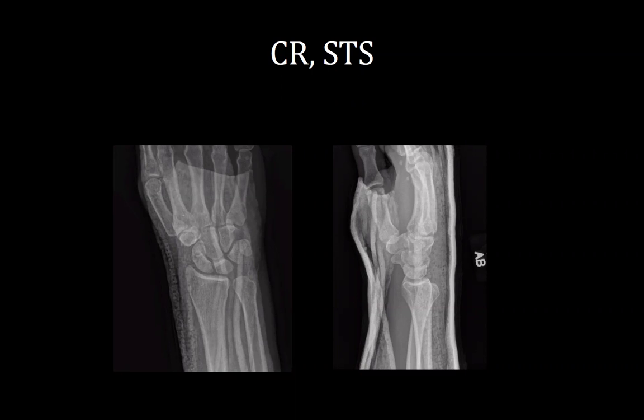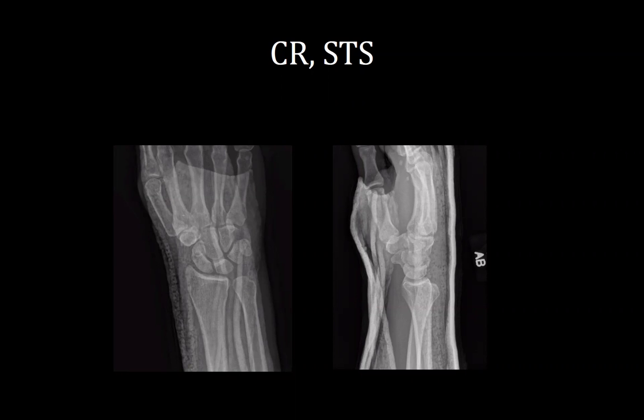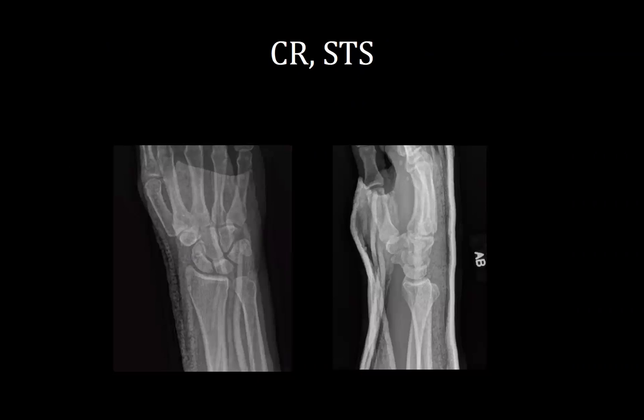Ken, it might be hard to see, but does it look like there's a possible old ulnar styloid non-union on the AP that you're showing? Yeah, I can really only see it on this view, and when I was using fluoro, I didn't really appreciate it. I didn't see it until I did these post-splint films. I didn't see anything on the initial injury x-rays that made me concerned for it. I'm not sure if it's just an artifact of the splint, but when we see him in the clinic, he'll get new x-rays and we can get a better view with the splint off.